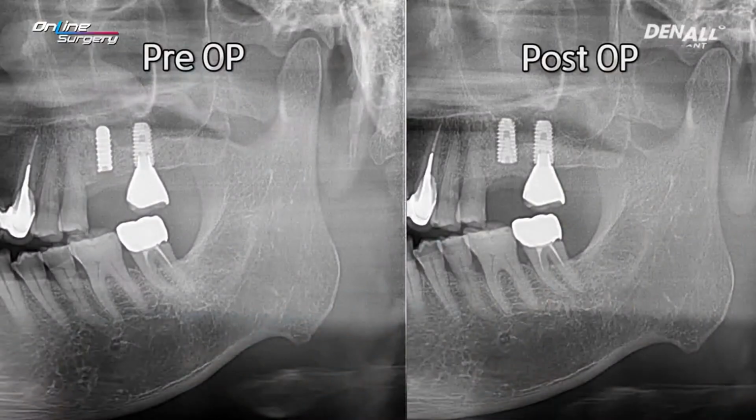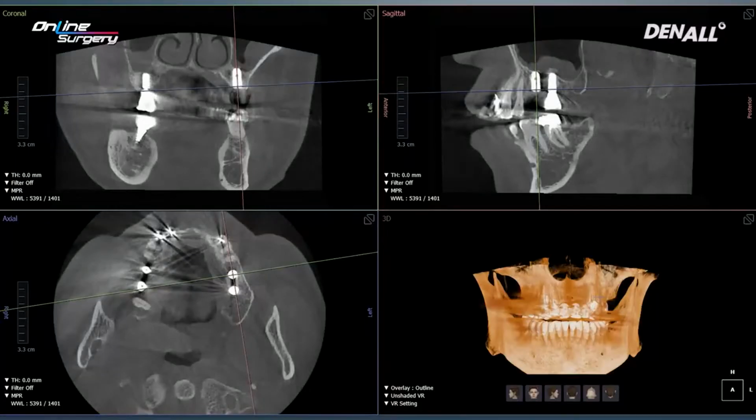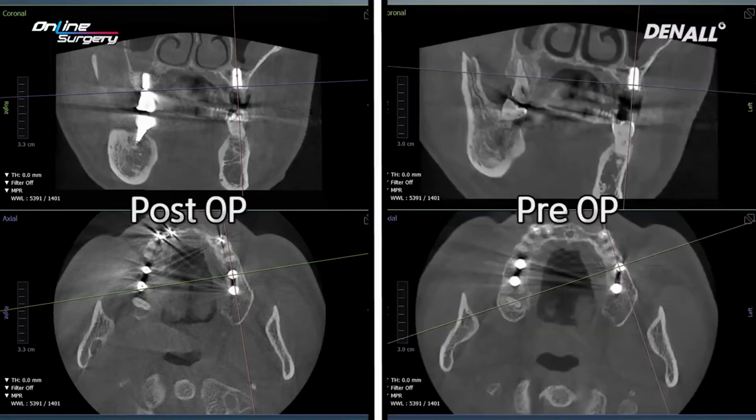I removed the S implant, which was diameter 4.1, and in the same area, a 5.0 by 10 millimeter implant was placed. In the post-op image, you can see that the TS3 5.0 by 10 millimeter implant was placed where the fractured implant used to be. You can see that the position and the distance with the posterior implant is all good. In the case of the fractured implant, it was rather buccally inclined. However, the new implant has been placed in the desired position.